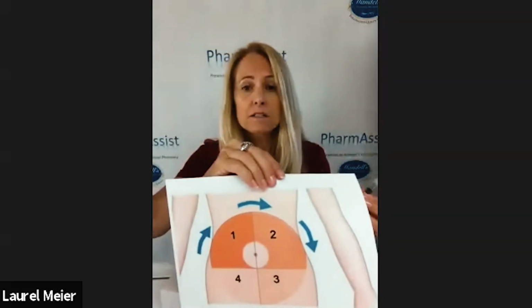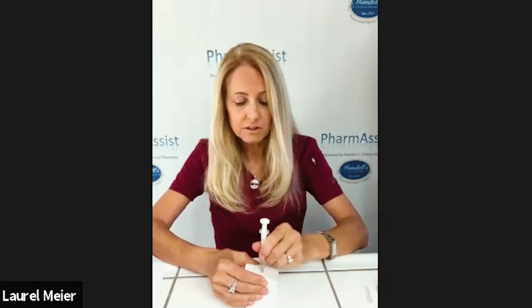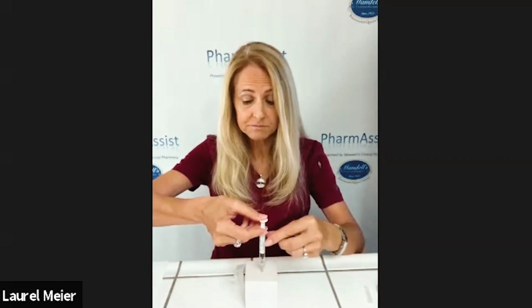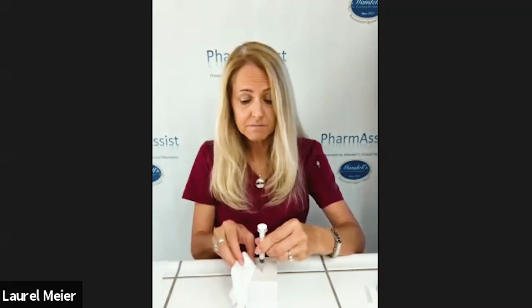So this is given in the abdomen. Pick a spot, stay an inch away from the belly button. Don't inject into a spot that has a bruise from a previous shot. Anywhere you can pinch some fatty tissue, just give it a pinch, inject straight in at a 90-degree angle, let go of the pinch, inject your medication, wait 3 seconds, grab a Kleenex, pull out and hold with the Kleenex.